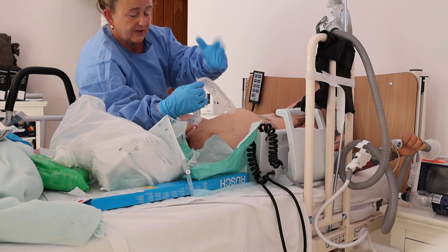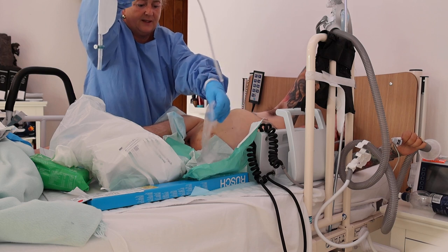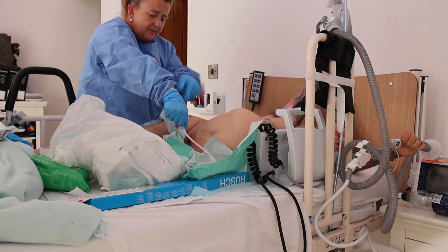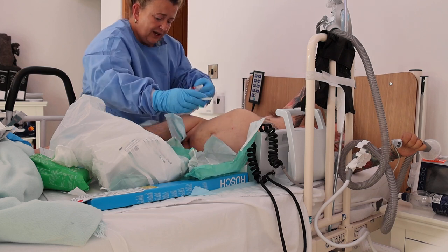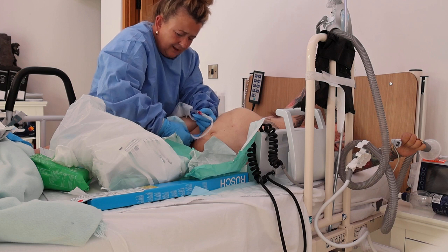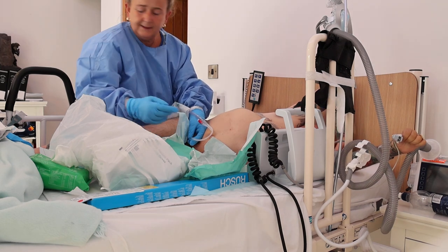So what I'm going to do is I've got two sterilised hands. Yes, I'm going to take this out with all its lovely stuff. You can pop it into the tray gently, across his body as gently as you can. But do not put the catheter anywhere. Grab the catheter itself, open up the stoma, in it goes. And there's a little tiny resistance, that little tiny bit, and then it sucks in to pop into place.